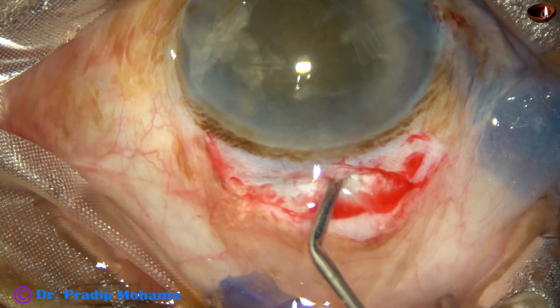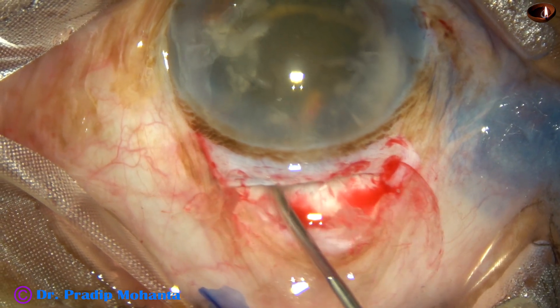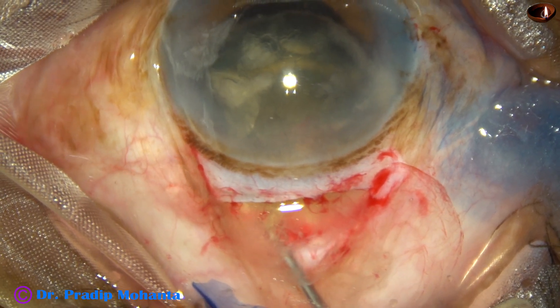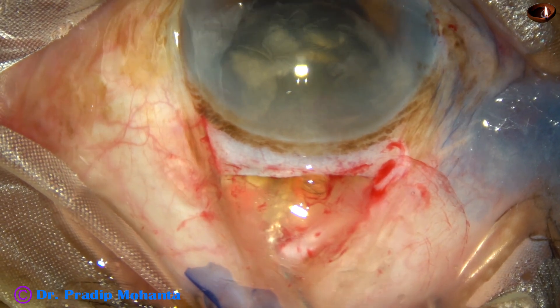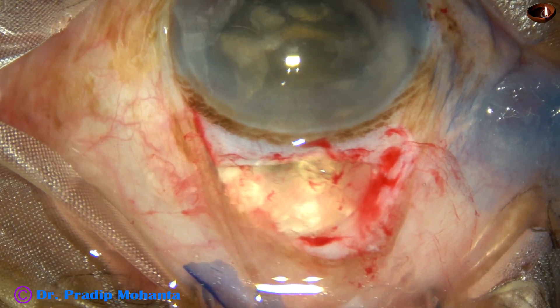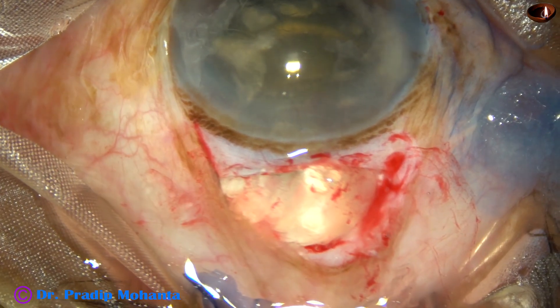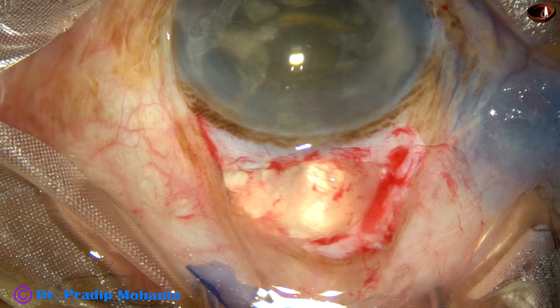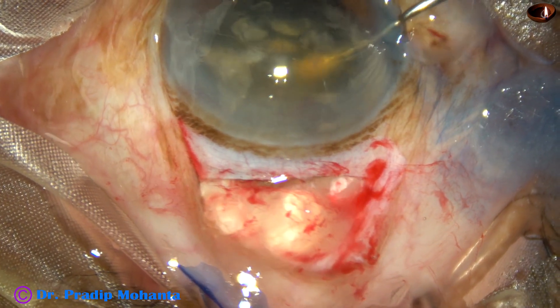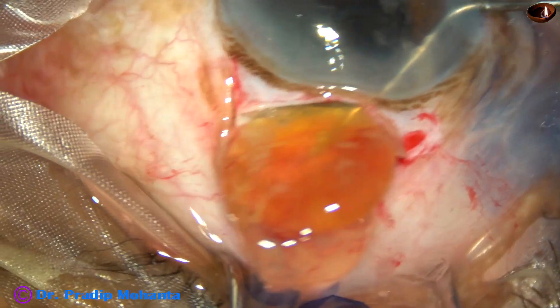In this case I am going to try viscoexpression — injecting visco to see if the nucleus comes out. I find that it's not coming out, though the main wound is quite big, about 7.5 to 8 millimeters. So I take a Sinskey hook, go through the side port, and push the nucleus from behind. And it comes out.